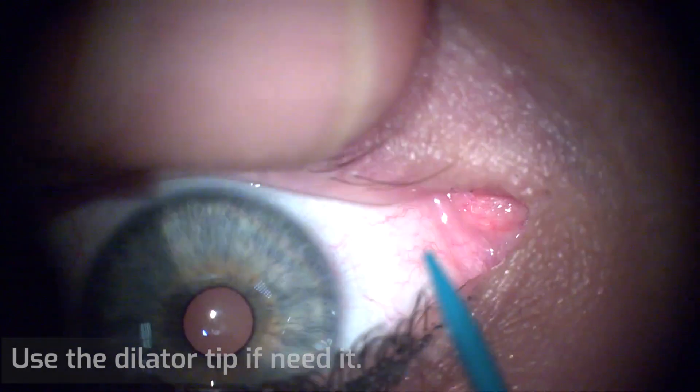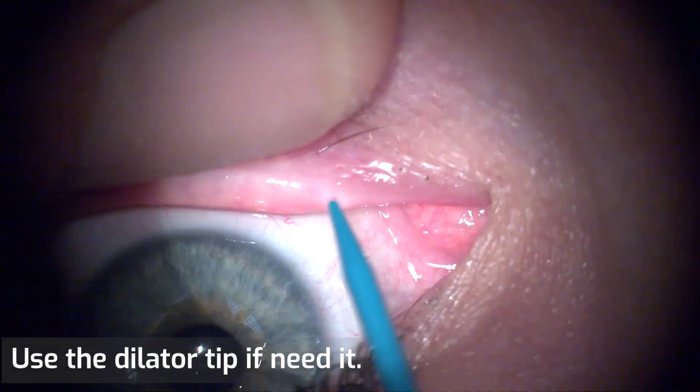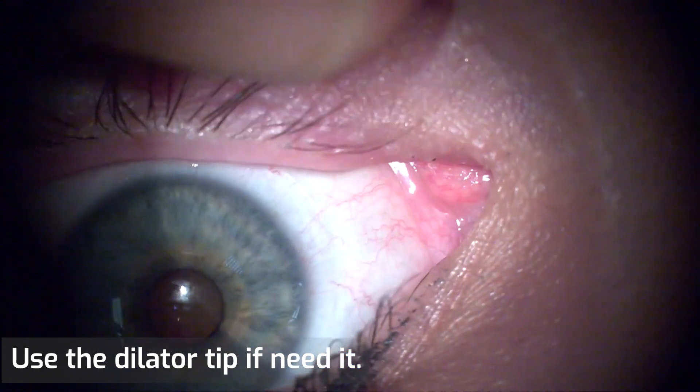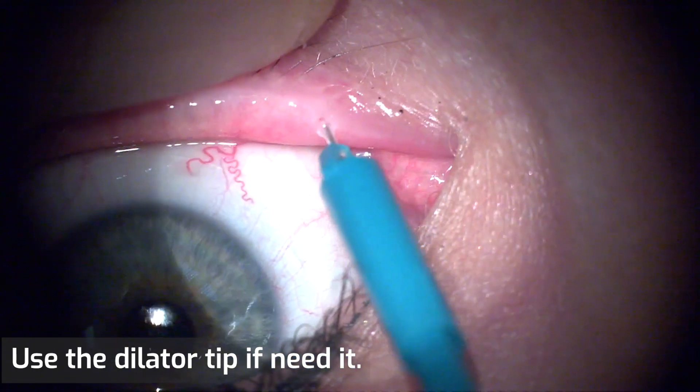While dilation of the inferior punctum is not necessary, the practitioner may decide to dilate the superior punctum slightly depending on the individual case.